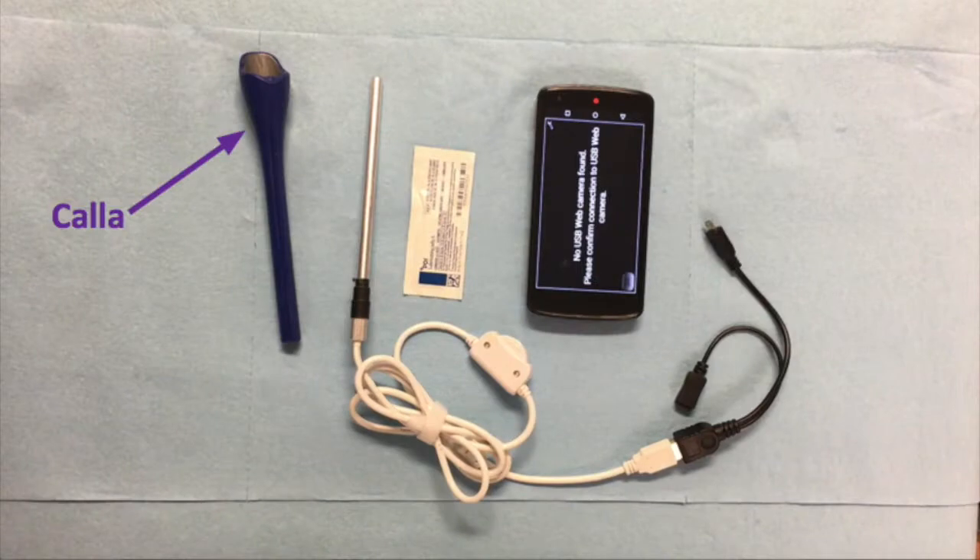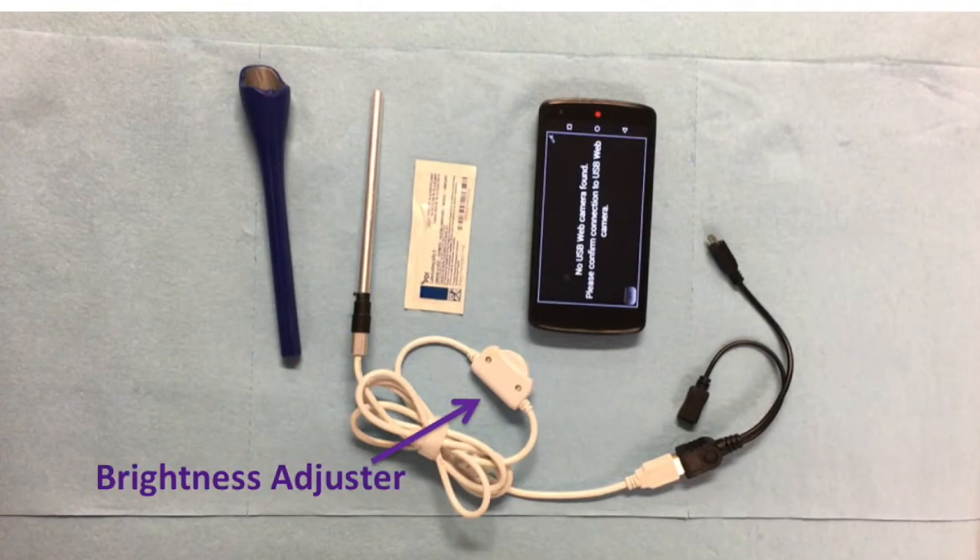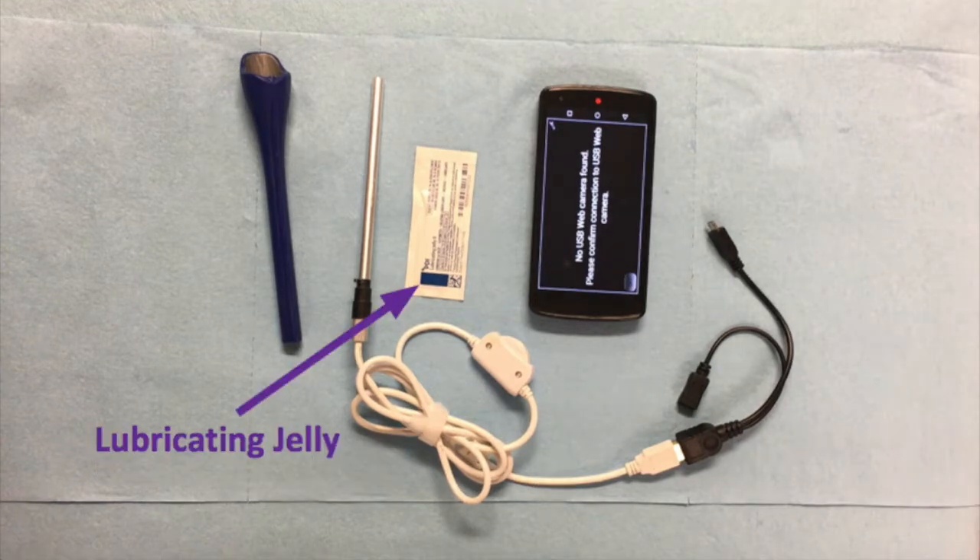I'm Jasmine. Today I'll be showing you how to assemble your Calla. In your package, you should see a Calla device, a camera with a bayonet locking mechanism, lubricating jelly, and a phone.